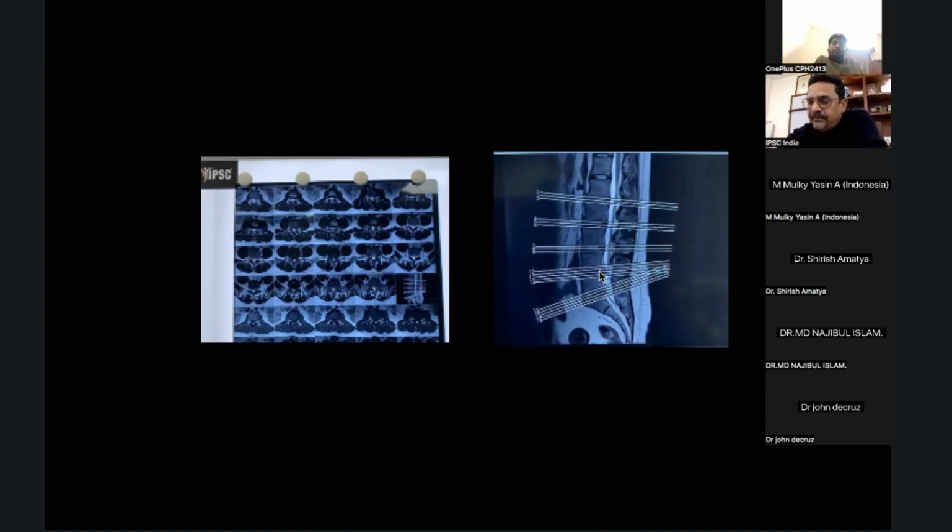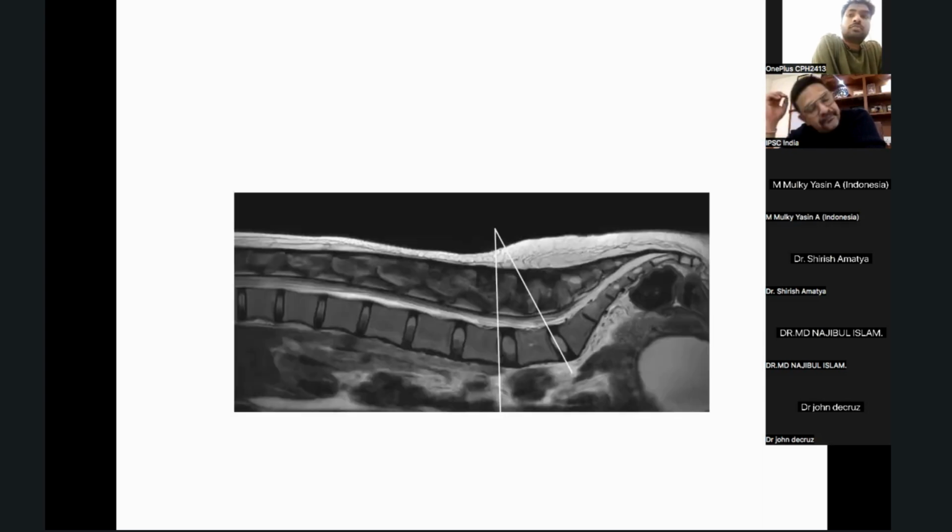Sir, what is your choice? Do you do parallelization? For me, I do it at operative time. I basically do the transverse view and the inclination view, and then I decide. But as a standard, to give people an idea, on the lateral view you need to be at 12 to 13 cm. And then you have to angle it depending on where you are.